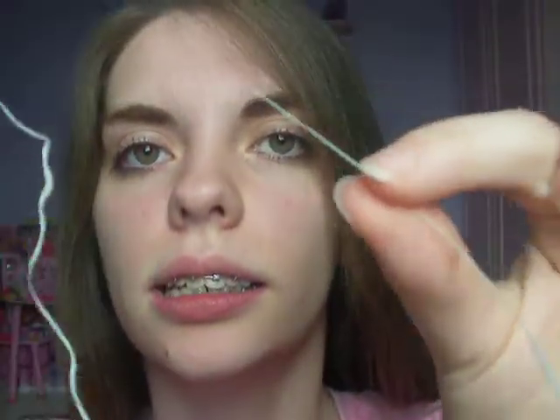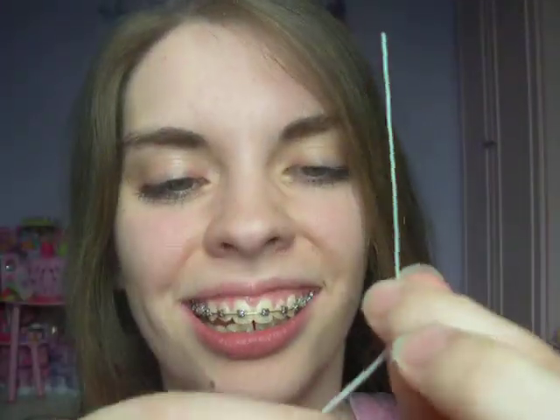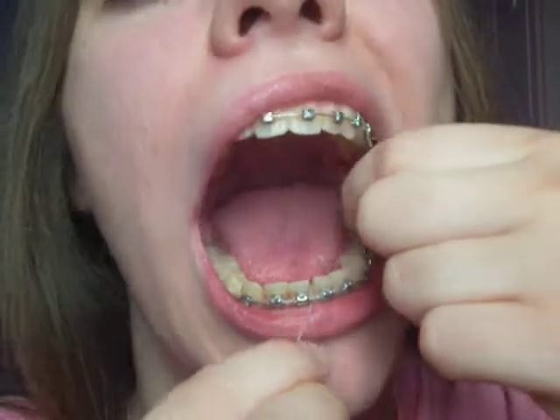Flossing's a bit trickier because obviously you can't use ordinary floss while you've got the wires there, because you wouldn't be able to get the floss down to your gum. There's two options available. This was given to me by my hygienist. It's a thick floss. Actually looks a bit like shoelaces. It's got this thin, kind of pointed end, so you can get it in underneath the wire, pull it through, and you can get it right down to the gum that way, which you couldn't do with ordinary floss, obviously.